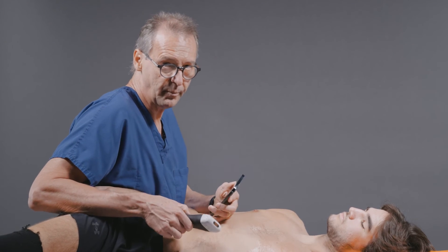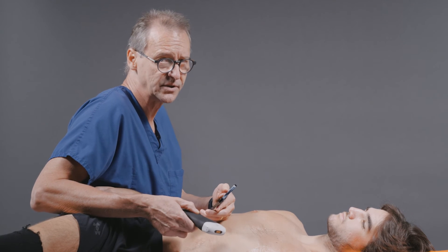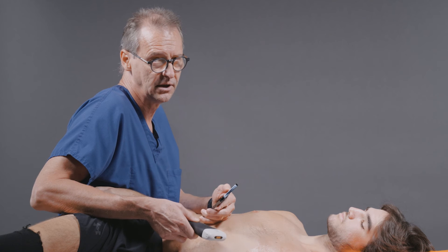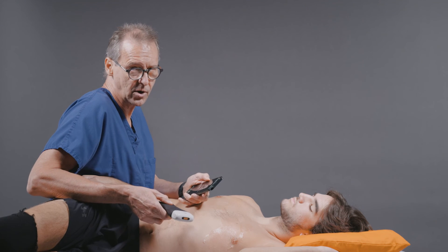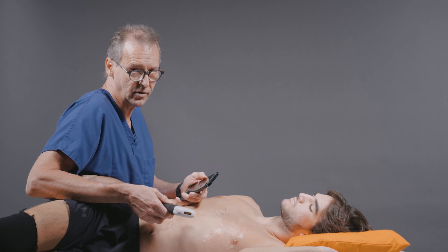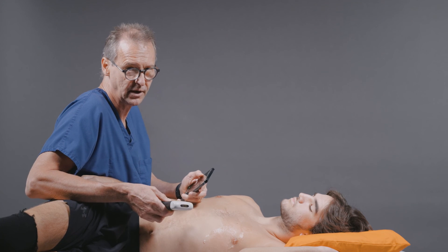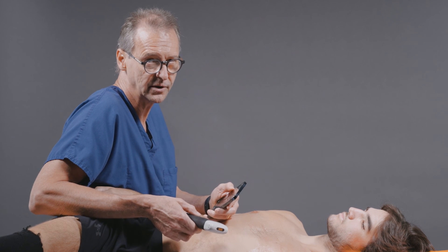And so there you have it. It only took a couple of minutes. We were able to examine all the chambers of the heart, the valves, both hemithoraces, and the pleura — looking for a number of different pathologies including left ventricular function, right ventricular function, pulmonary embolism, hypovolemia, evidence of pericardial effusion, and pulmonary edema. All of these are critical diagnoses for physicians in emergency department or critical care settings, but it's also important that physicians in clinic settings such as internists and family practitioners have this capability as well.